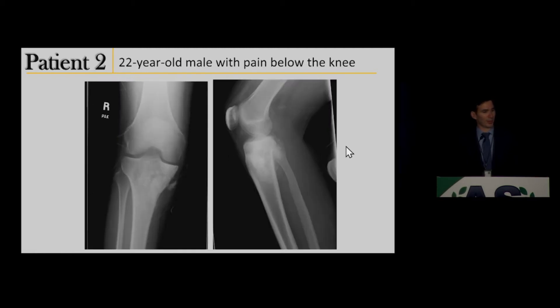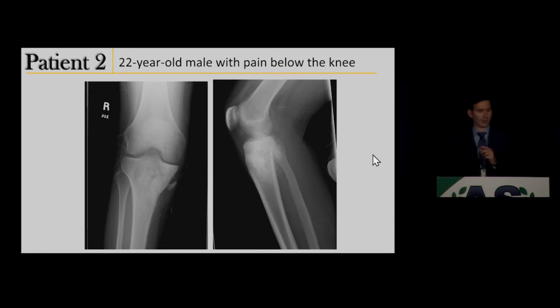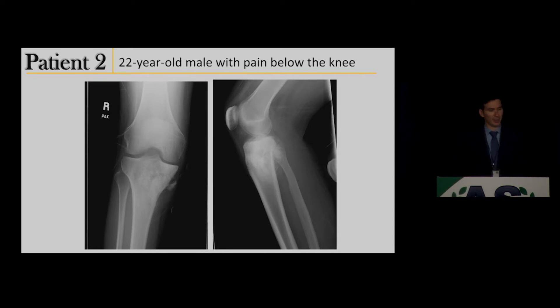Case 2: a 22-year-old male who had pain in his knee for quite a while, had been limping more recently, then came into the ED and got this knee series.